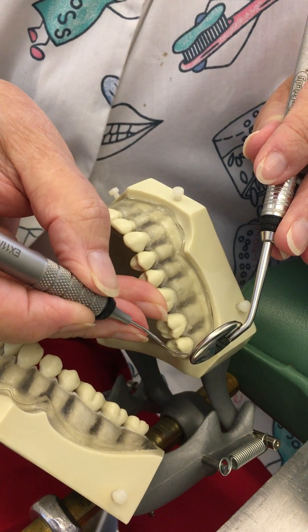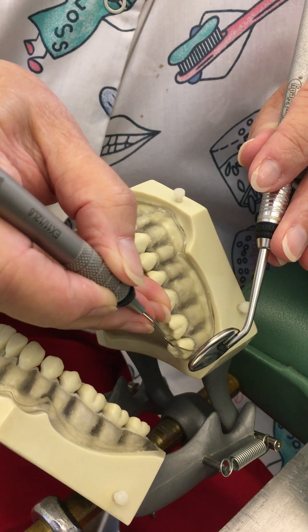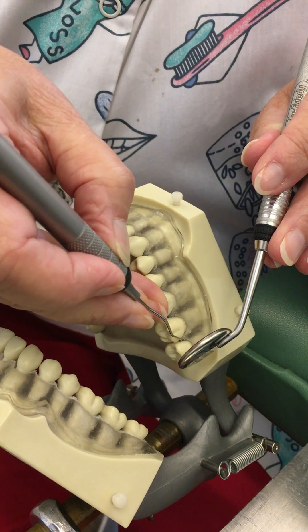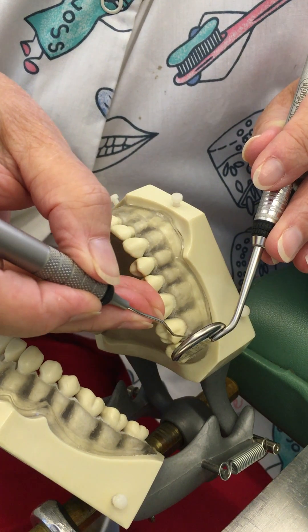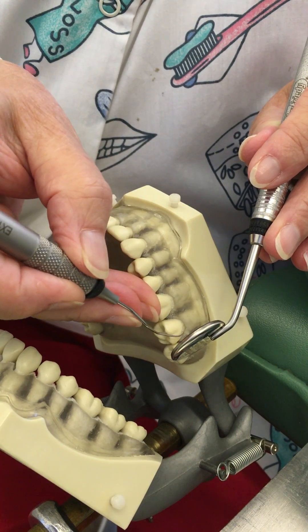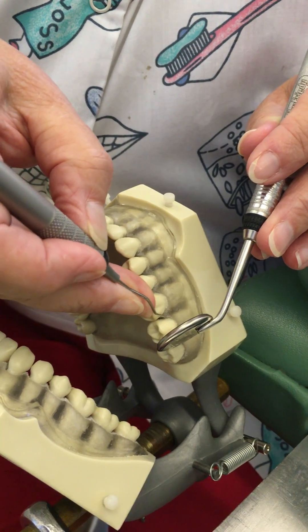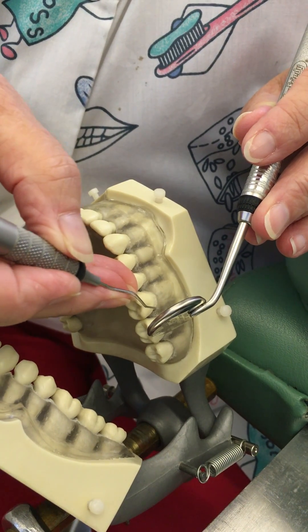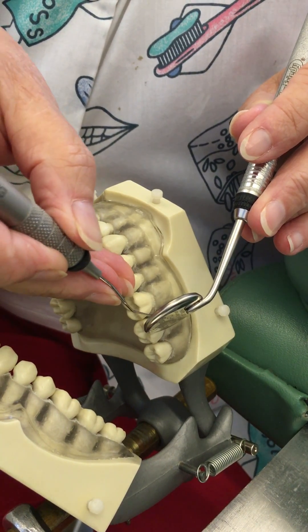I didn't stretch my fingers to get there — I just rocked up on my fulcrum and it put me right there. Now I'll turn it and go in the distal direction; same thing, rock up, it puts me at the distal line angle. Adjust my grasp, move to the next tooth, shank on the buccal. As I move from tooth to tooth I'm shortening up my instrument and backing my fulcrum up so it moves more anteriorly.